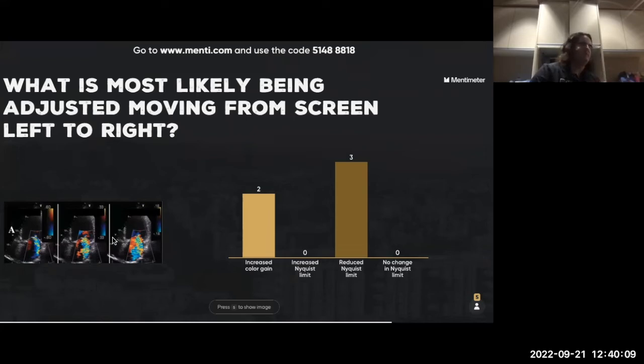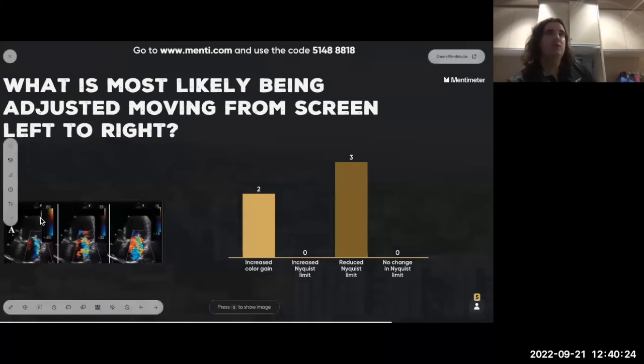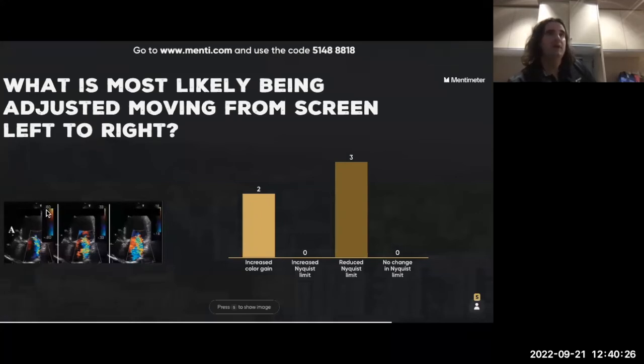In blood vessels, we're often at, say, 10, for example. But you can tell here, if you misapply the color scale, a jet may look far more impressive than it really is. Okay, so always check the color scale when you're using color Doppler. And if you, for example, use 60 and we're looking at a vein, a blood vessel, then you may see very little color change, because your color shift is very, very low.